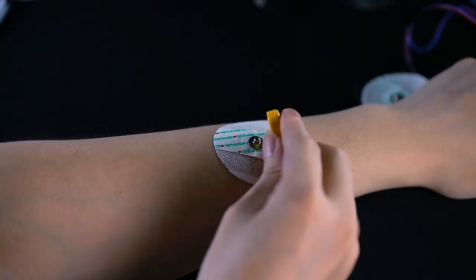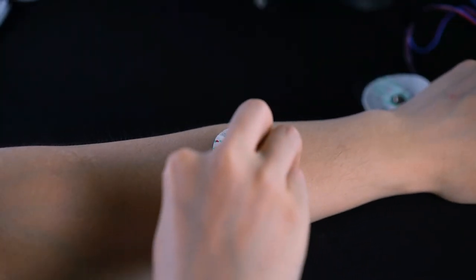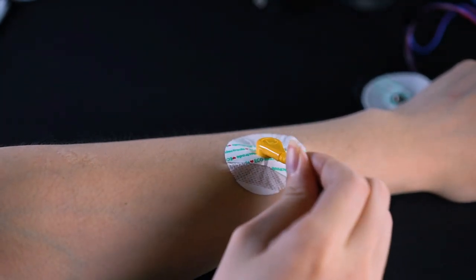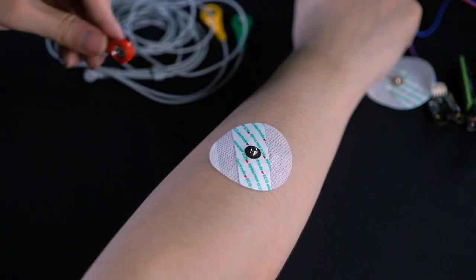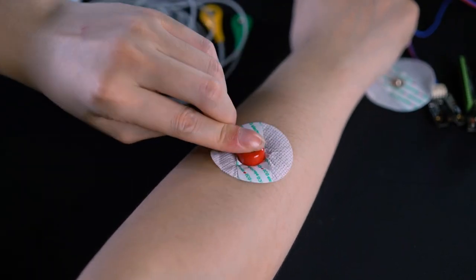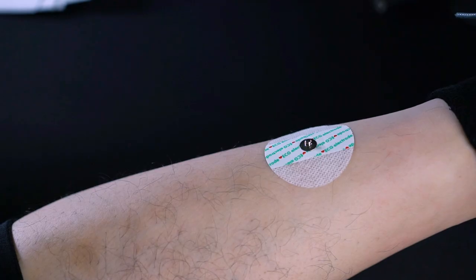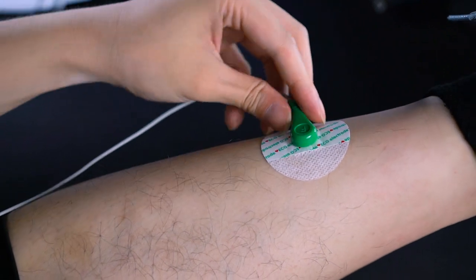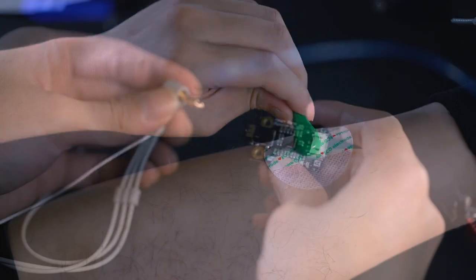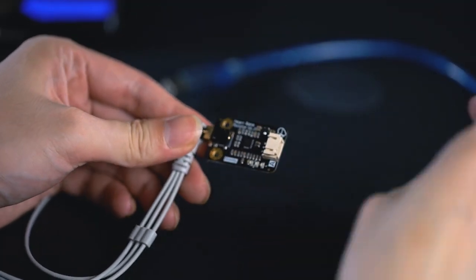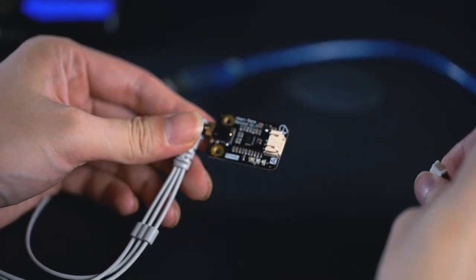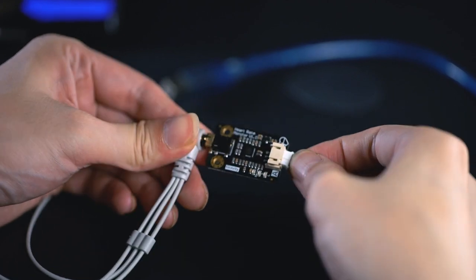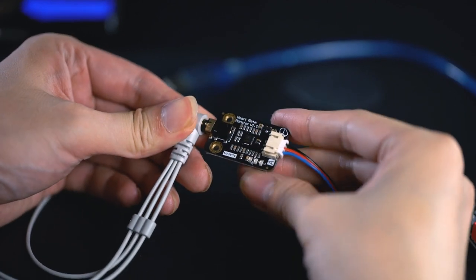Then, clip the lead onto the conductive pad, yellow to the left arm, red to right arm, and green to right leg. Next, connect the AD8232 chip in between the lead and your Arduino board.